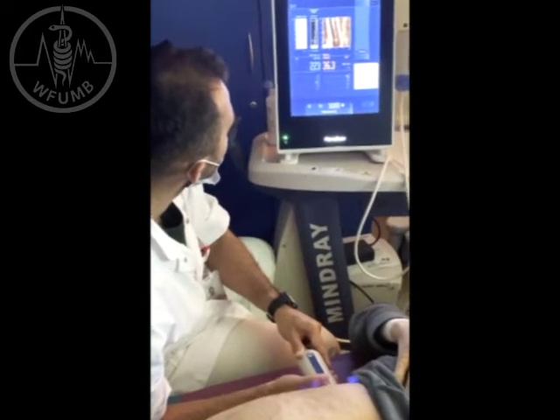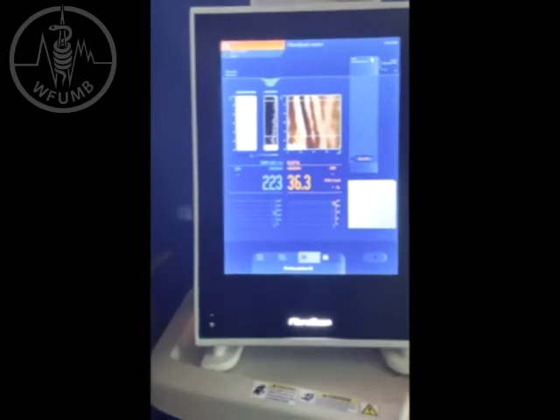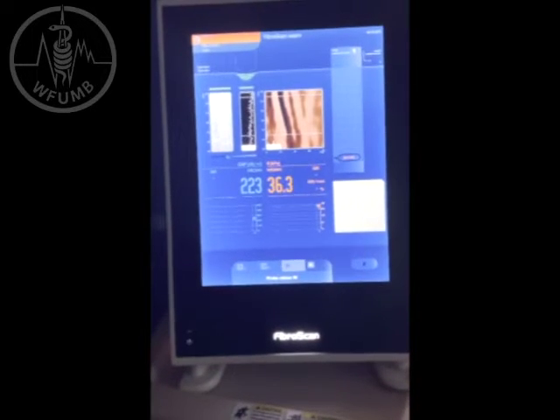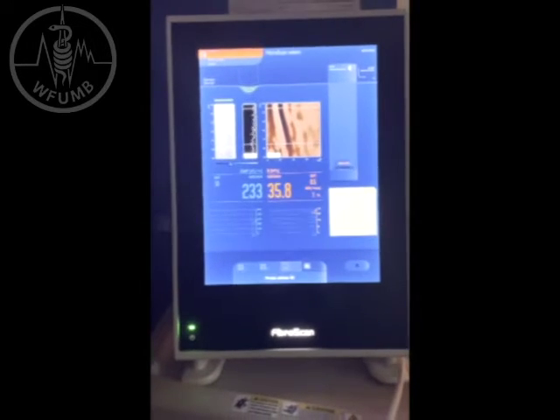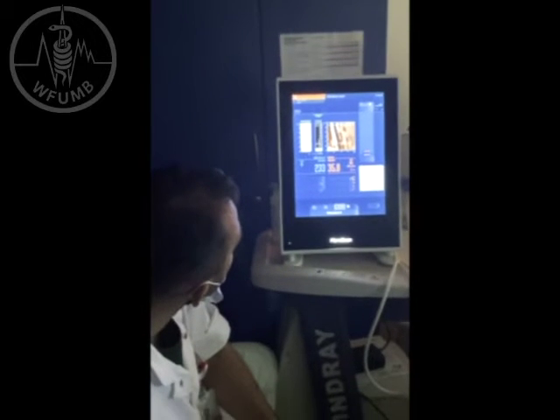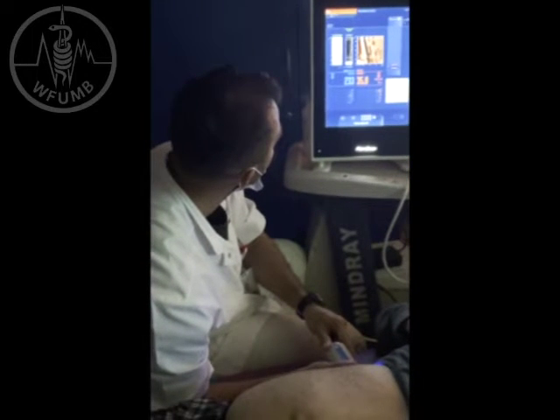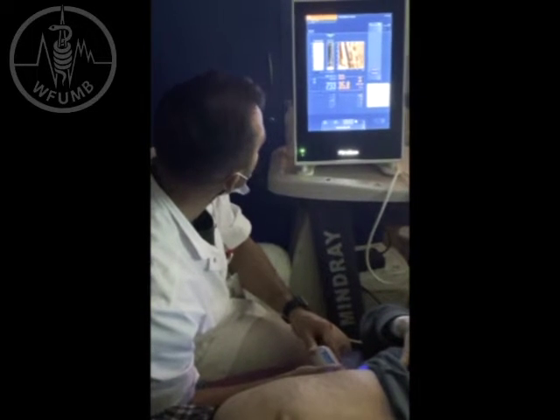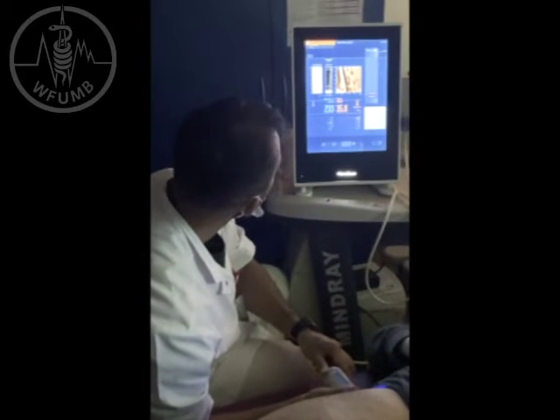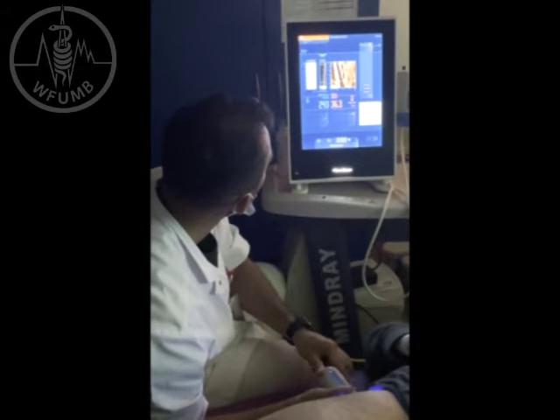Okay, we have our first measurement, which is 36.3. Then we perform 9 additional measurements until we have 10 valid measurements. We always take a brief moment between measurements. It is not recommended to perform the measurements rapidly. We can wait a few seconds between measurements until we have a green homogeneous line in the upper part of the image.